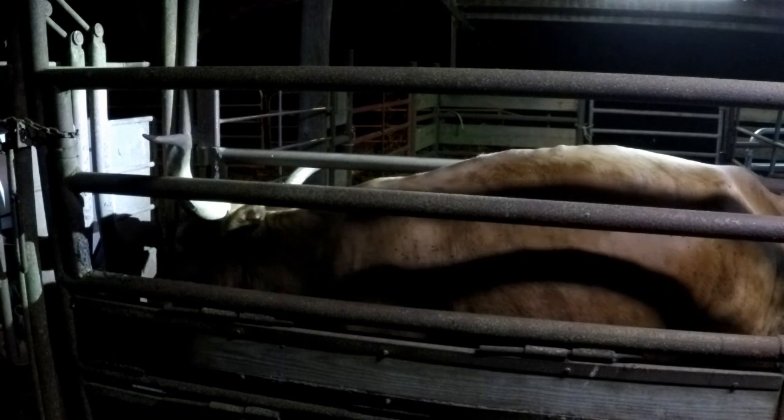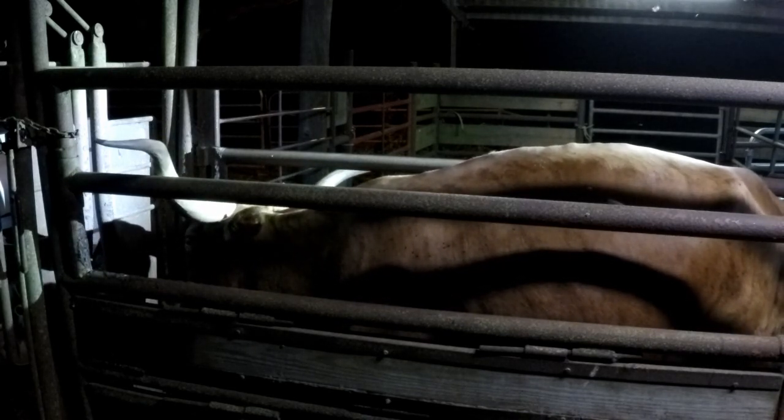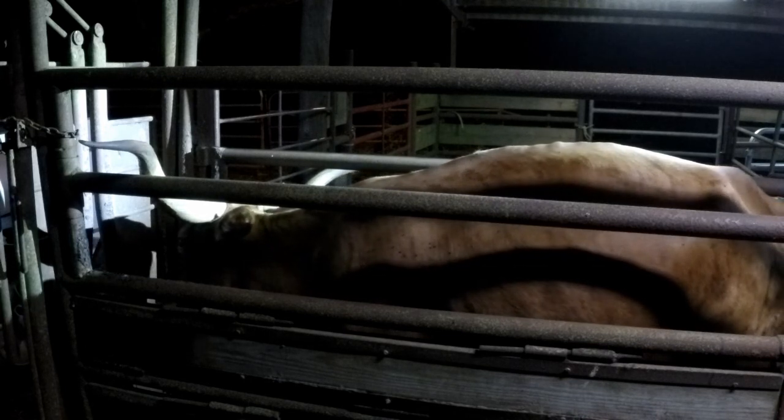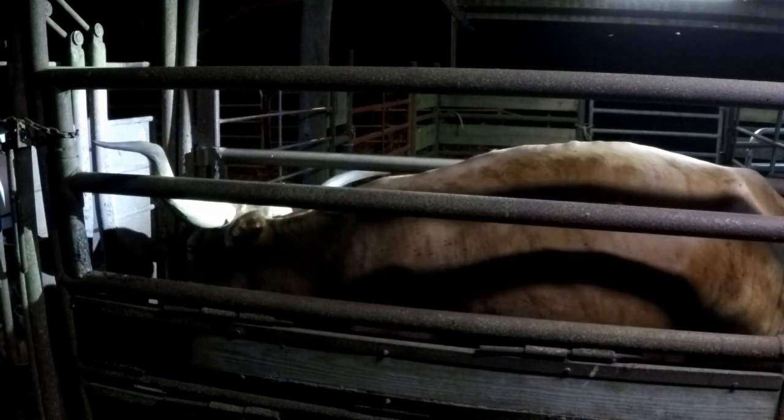All right. Got me in far enough where I can search for the cervix. I've found the track. Normally, longhorns are right at the back, and this one is as well. So, I've barely got my hand up to my wrist, and I've already got the cervix in my hand.